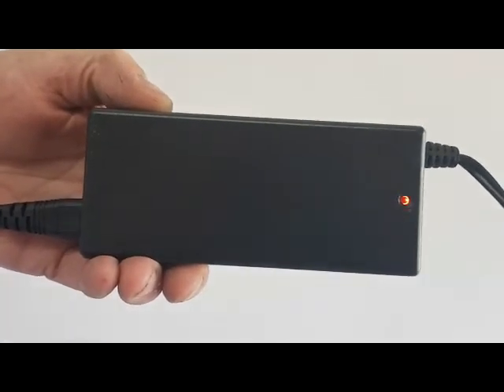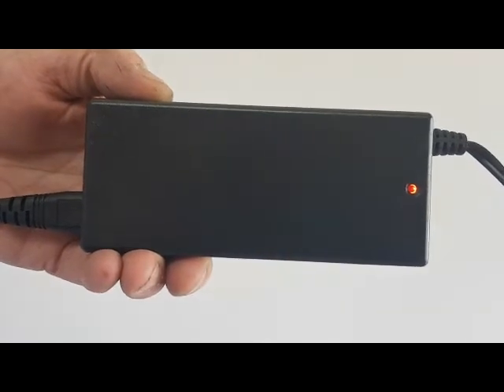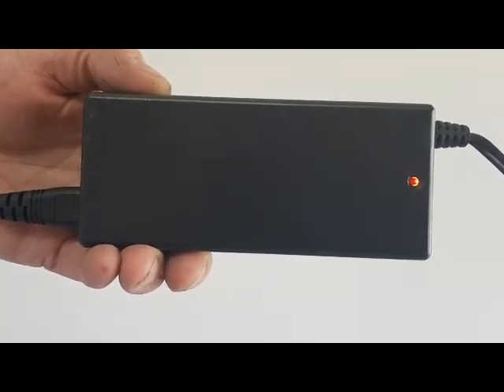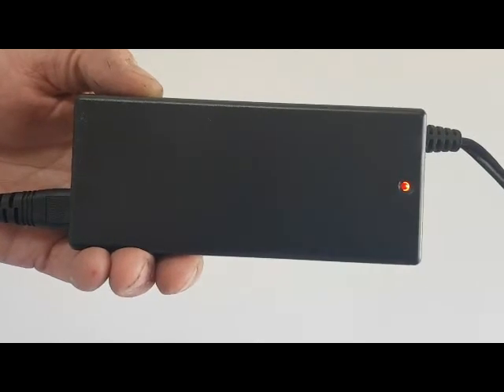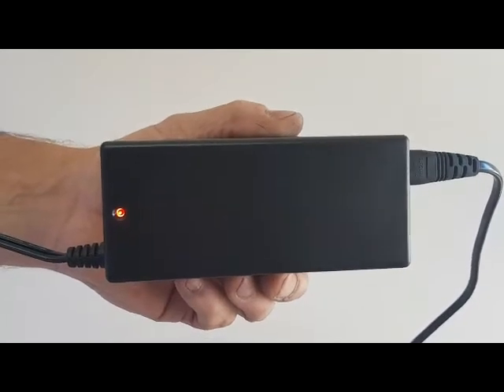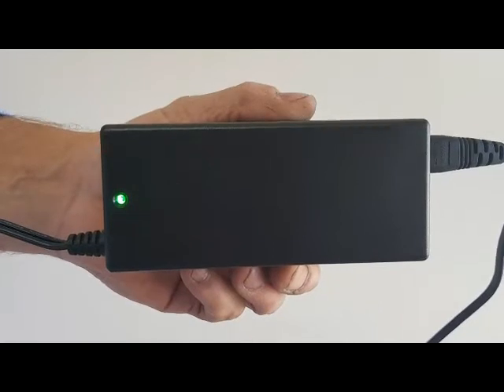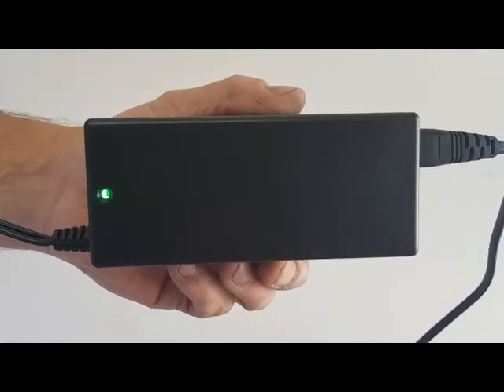The charger is fully automatic and will return to green when the Genie Pill Crusher is fully charged and ready for use.